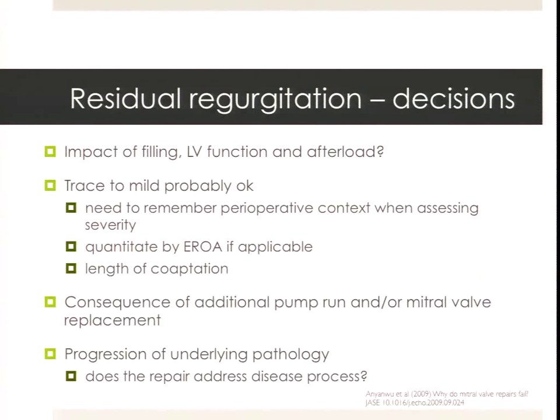So first of all, you need the heart to be appropriately full. You need to look at what the LV function is doing, and you need to have an appropriate amount of afterload. All those things need to be addressed. If you ramp up the afterload too high, on an overstretched heart that's dysfunctional, then you're probably not being fair to it. So you need to bear those things in mind.